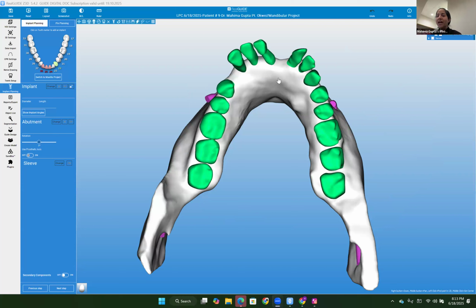So regarding 22, the implant is going to be exactly as if I'm replacing a single tooth. Correct. That is not going to be in the embrasure of 22 and 23, right? No. I would put it at 22 there because you need the implant right where the force is for the lateral excursions. And anteriorly, we are just doing it because it's so difficult to place implants next to each other because the teeth are too small. And then you'll also limit the amount of space in between them, for the better spread. Yes, I understood. That was the biggest concept I was not able to understand.